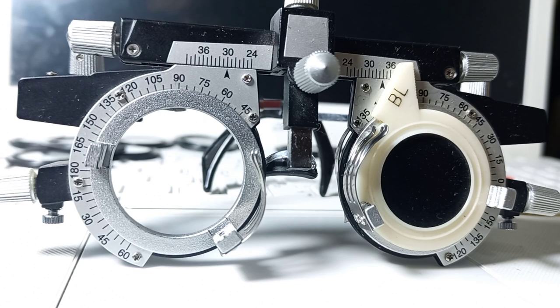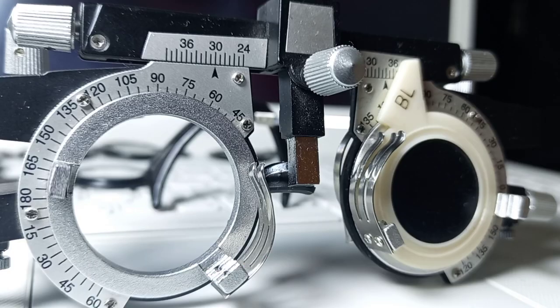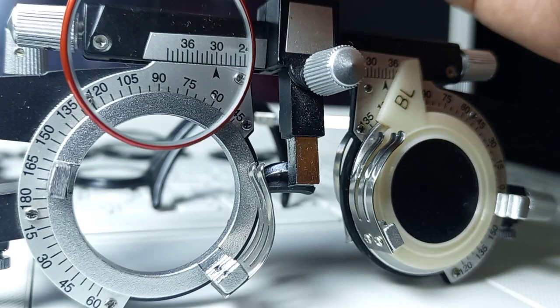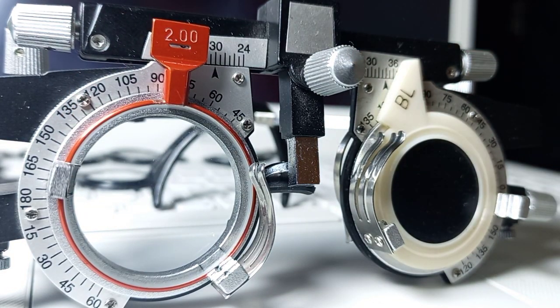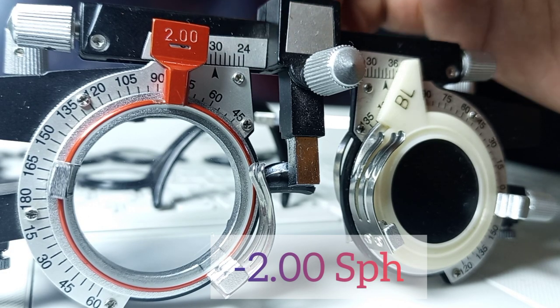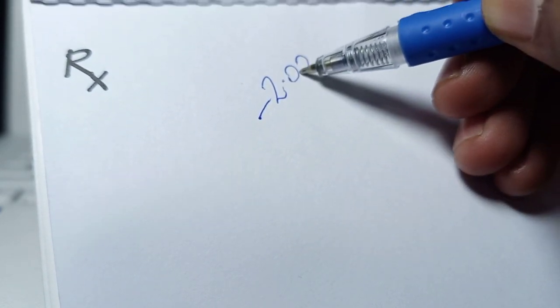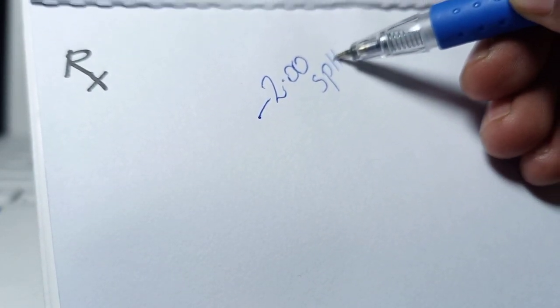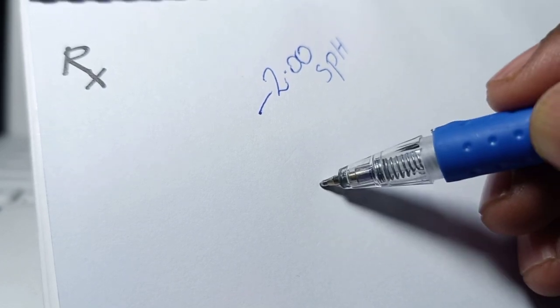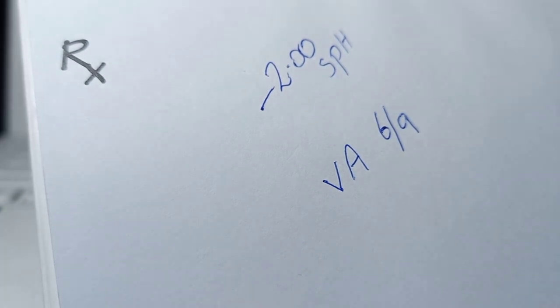Before treating the astigmatism, the best vision sphere of the patient should be established. We will place the best vision sphere before the patient's eye. As you can see, the power of the best vision sphere is minus 2 spherical, and the visual acuity of the patient was 6 by 9.